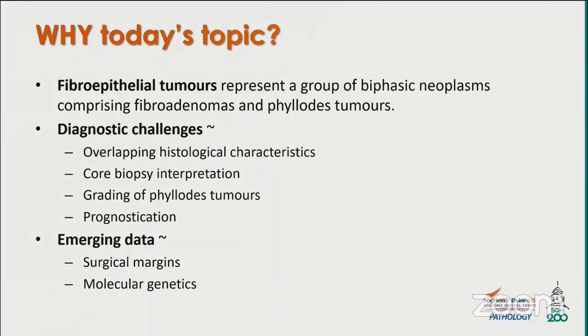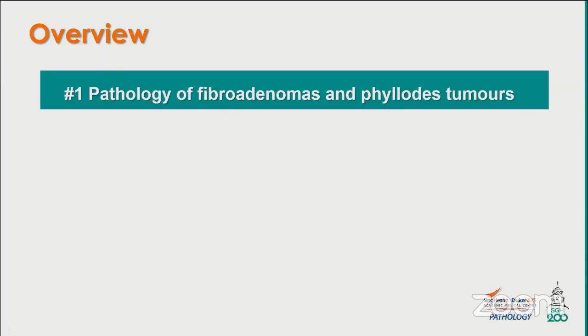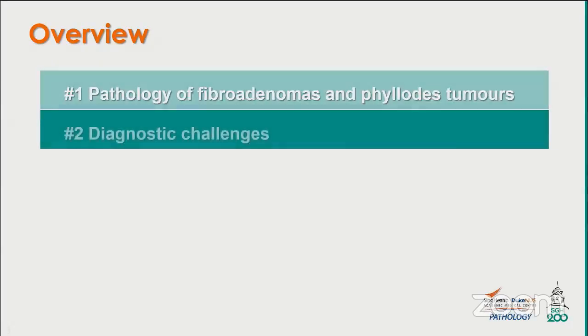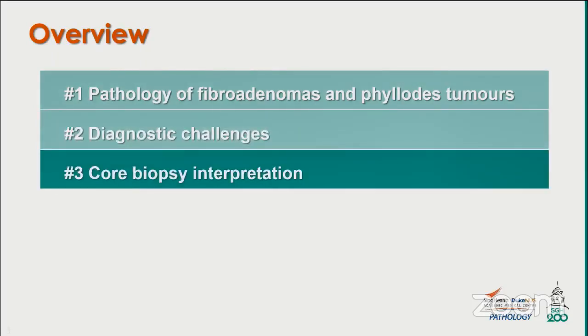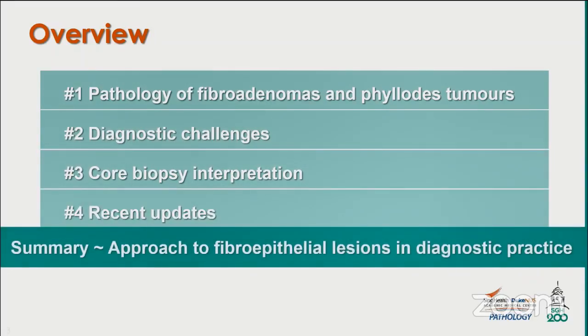their molecular genetics. So for today's talk, I will walk you through the pathology of these neoplasms, discuss diagnostic challenges, including an approach to core biopsy interpretation, and highlight recent updates, in summary, to provide a practical approach to the interpretation of fibroepithelial lesions in diagnostic practice.